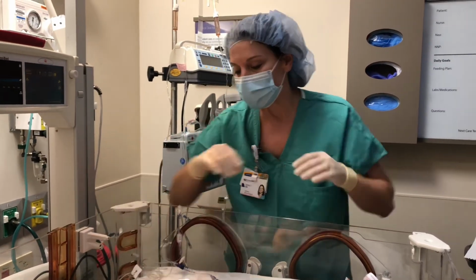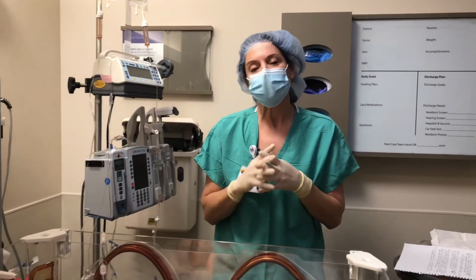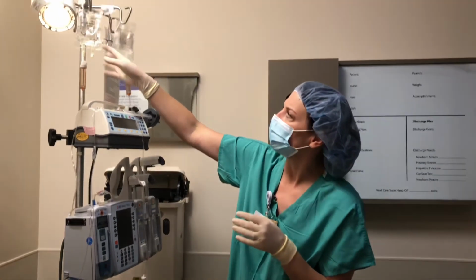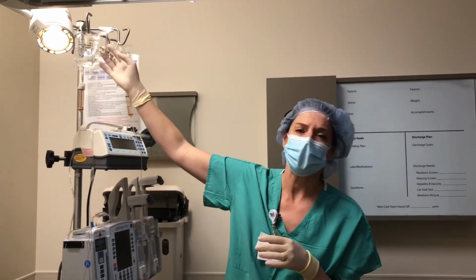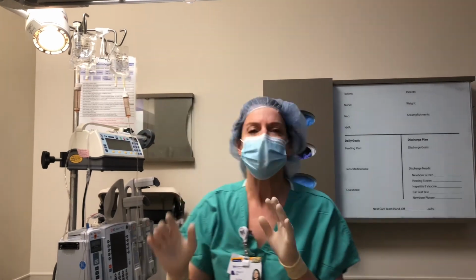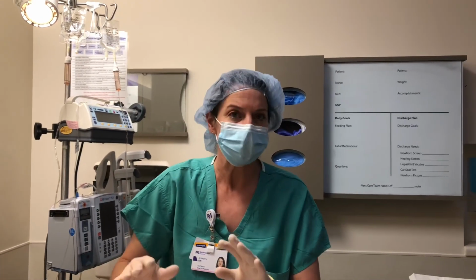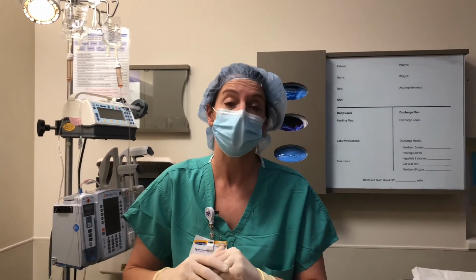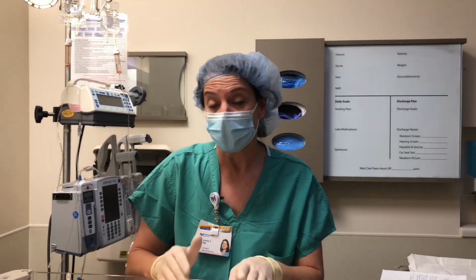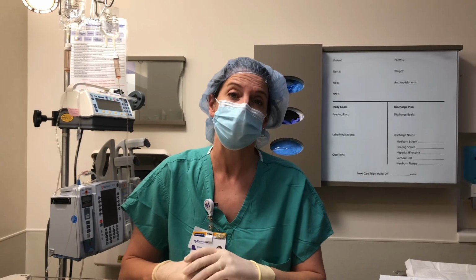And also as a safety measure, save the hemostats that they use when they insert the lines. It's really important for our central lines that we have at least one hemostat per line at the bedside, just in case there was an accidental dislodgement or something. We would have that for emergency purposes. So make sure that you have a hemostat, one for each line at the bedside in case of emergency.